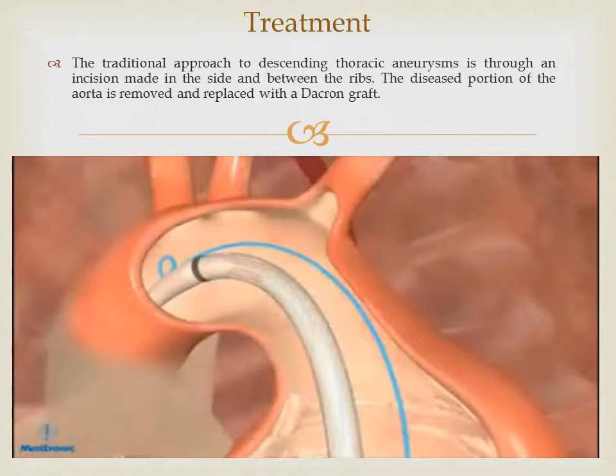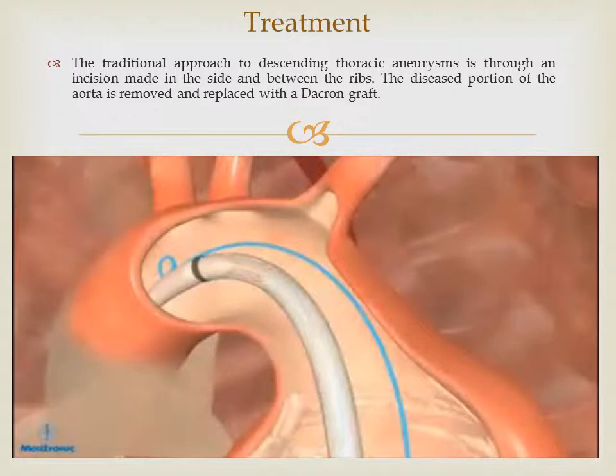Initially, position the proximal edge of the covered portion of the stent graft a few millimeters higher than the targeted landing zone. Confirm using angiography that the orientation and placement of the proximal end of the stent graft is exactly where you want it to land prior to deployment.